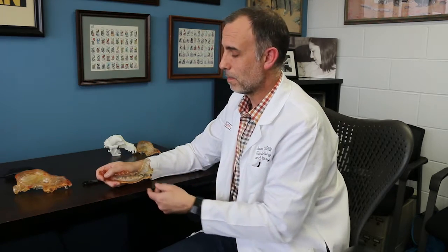One of the great advantages of this computer modeling software we use and the 3D printing is if we have a patient that has, for example, a broken left jaw, we can actually in the software model the patient's right mandible, the opposite side, and then in the software we can create a mirror image of that opposite mandible so that it mimics the left side. And by doing that, we can then print that normal left mandible.